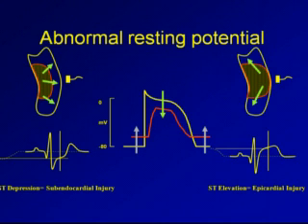That creates essentially a current in diastole. While nobody's depolarizing, everybody's at resting potential, everybody's supposed to be at the same electrical potential. If they're not, I've got a current during diastole. So then, instead of being at zero, I'm actually seeing a current come towards me in diastole. So the lead that's overlying that is going to register a positive deflection.